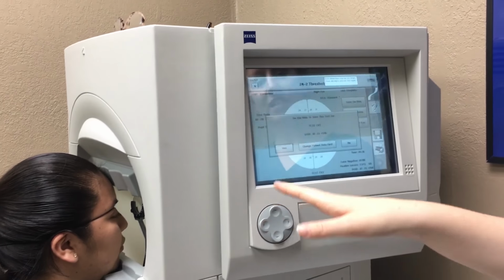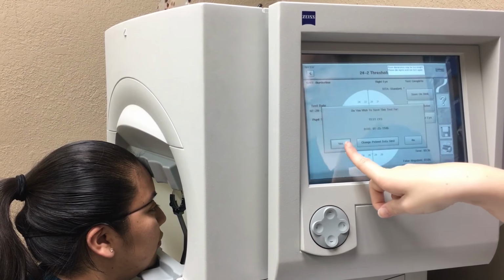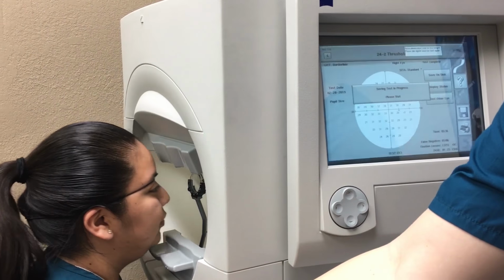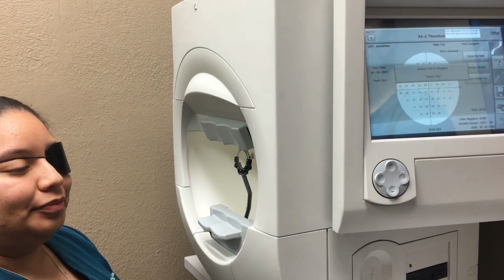So she has finished the test and this dialog popped up. Do you wish to save this test for this patient? Yes. Saving test in progress. You can sit back now. Great job on that test. I know that was long. You can take a quick break and please switch the patch to your other eye.